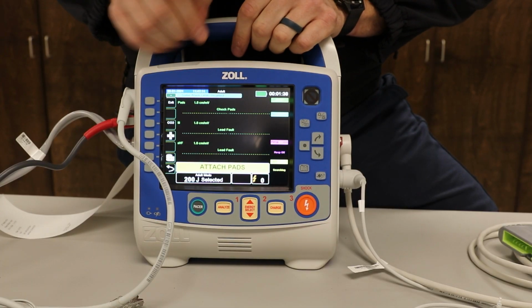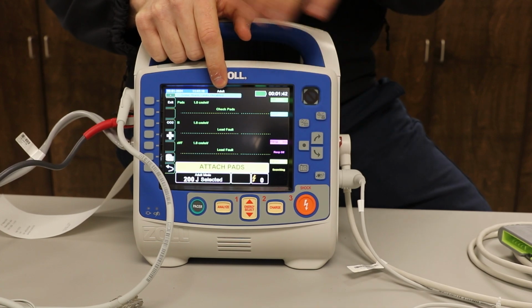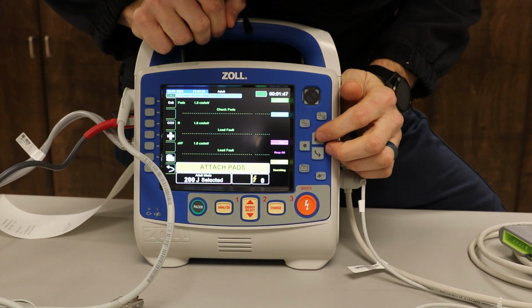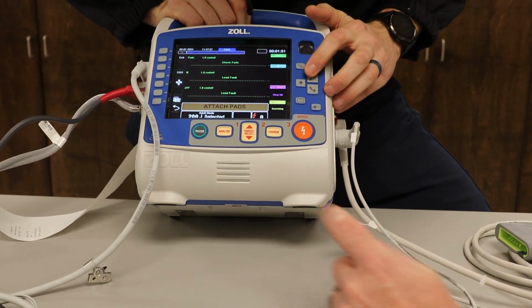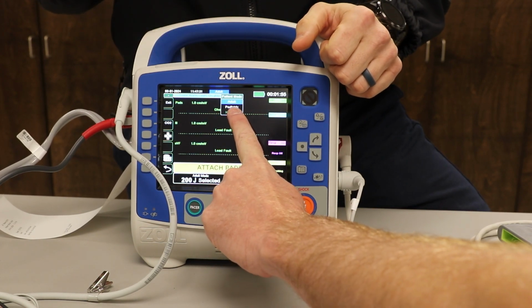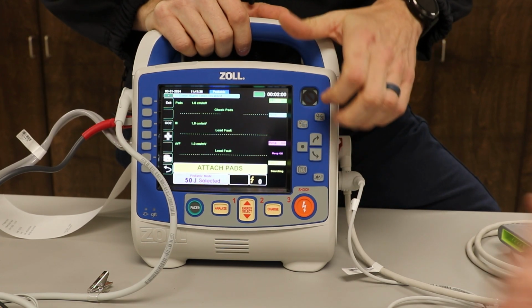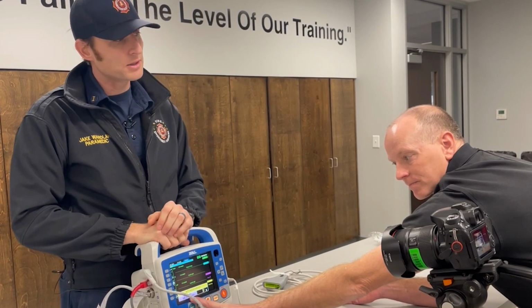So if we look at this and we look at the top, like David said, you see the highlight. We can navigate this entire screen. All we got to do is hit these selector buttons. Since we're changing to a pediatric mode, we'll select adult. You'll see you have 3 options down. You have adult, pediatric, neonate. We're going to go down to pediatric, select, attach pad. And it now has changed our joulage that we can give to that patient according to the patient we selected.